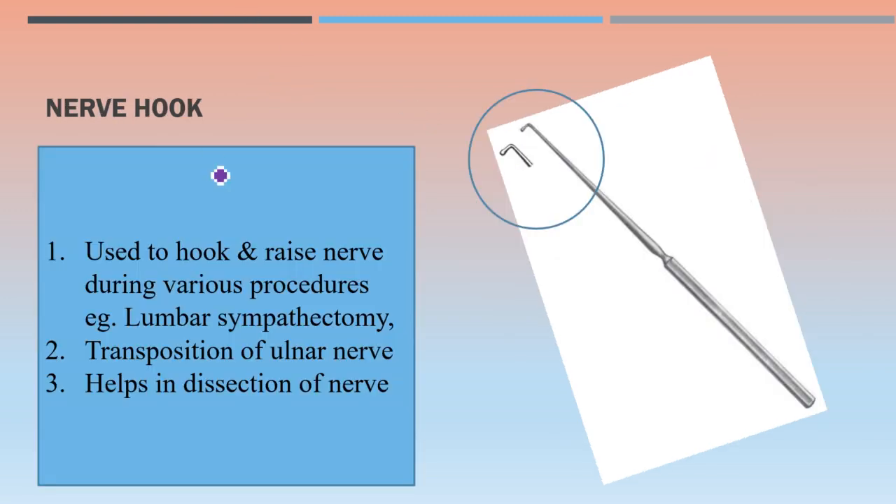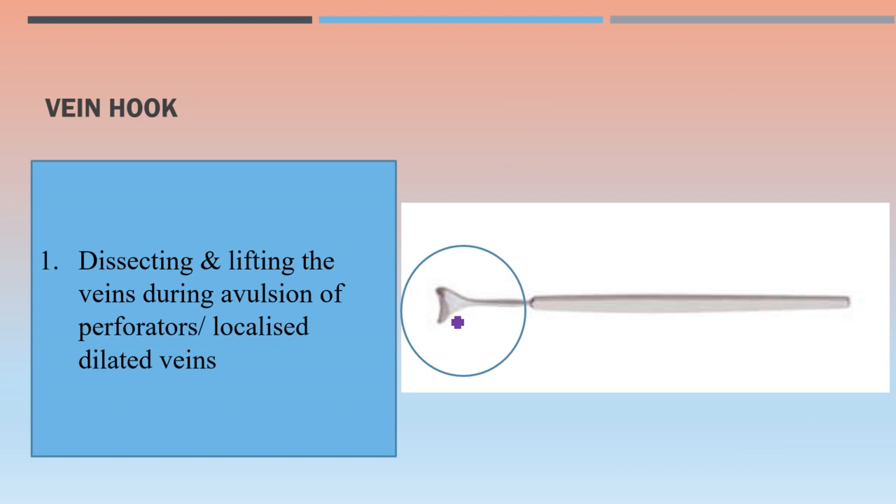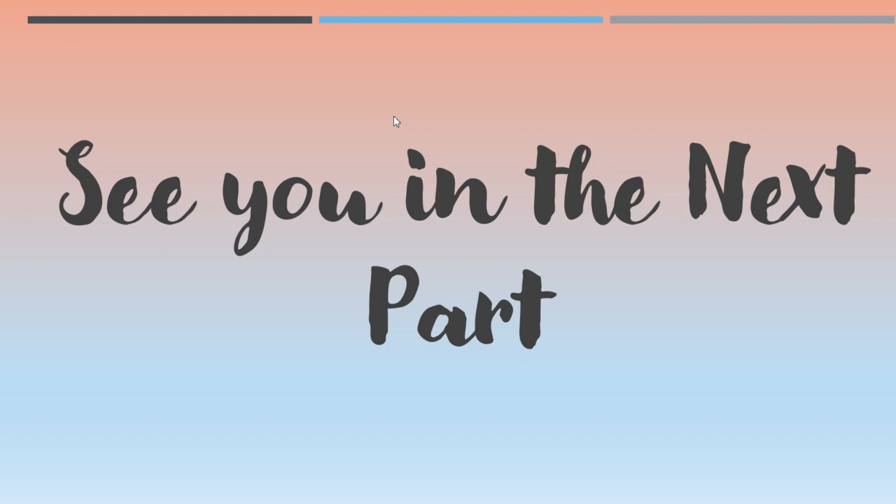The nerve hook is used to hook and raise a nerve during various procedures like lumbar sympathectomy or transposition of the ulnar nerve, and in any dissection of a nerve. This is done using the distal end. The vein hook is used for dissecting and lifting veins during ablation of perforators or localized dilated veins — with this instrument we can lift the veins.